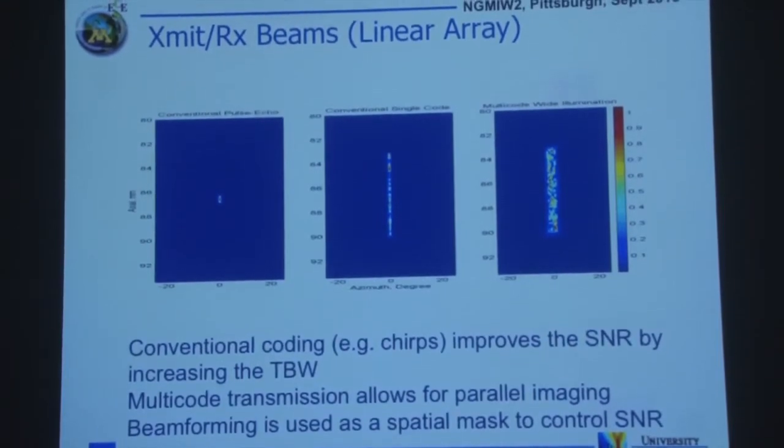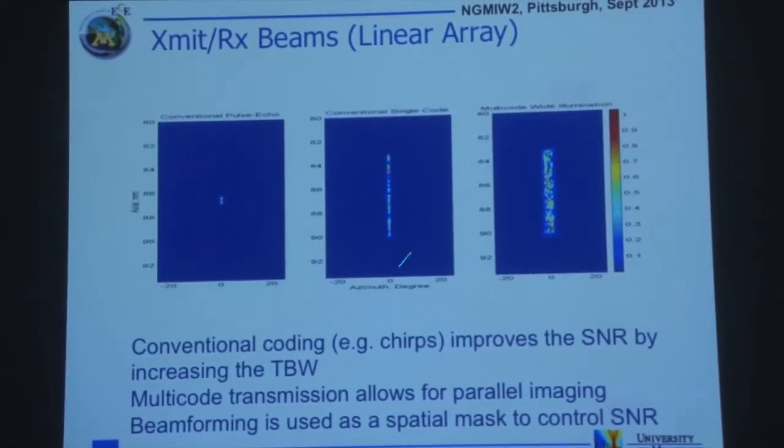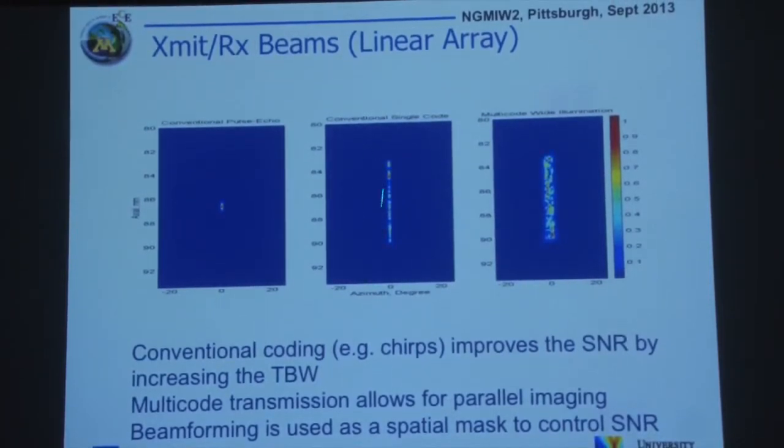Just very quickly, people talked about coding. A lot of the coding that people refer to is one dimensional, simply a single beam with a chirp or a maximal length sequence or a Barker code where you just extend the time and utilize the same bandwidth. So increasing the time bandwidth product gives you improved signal to noise.